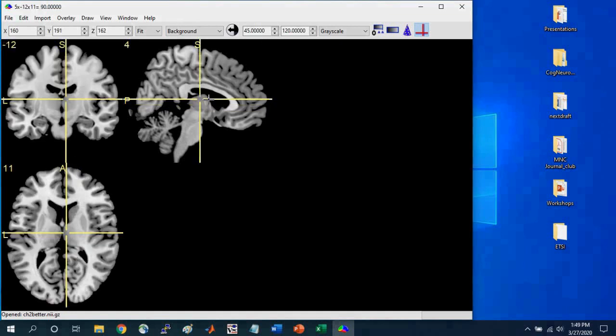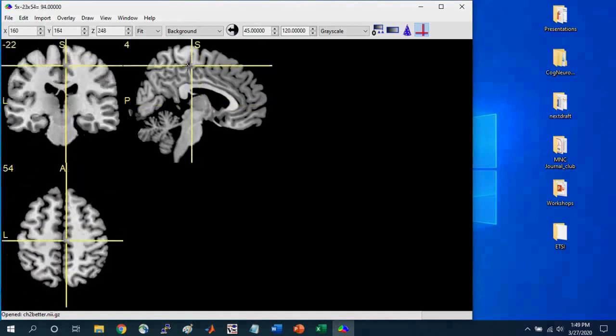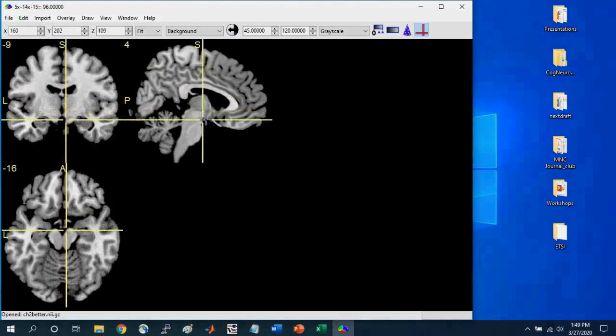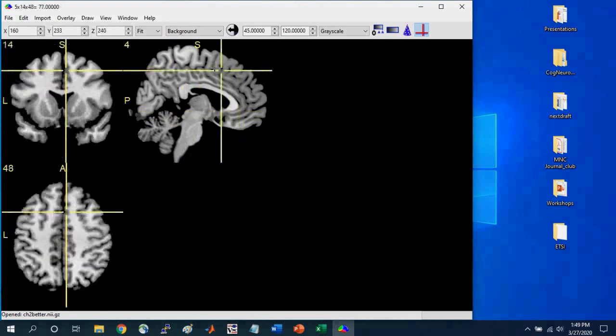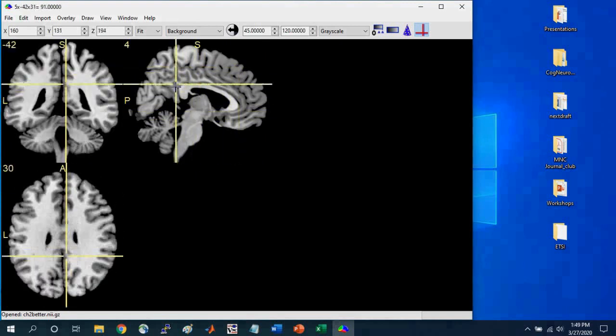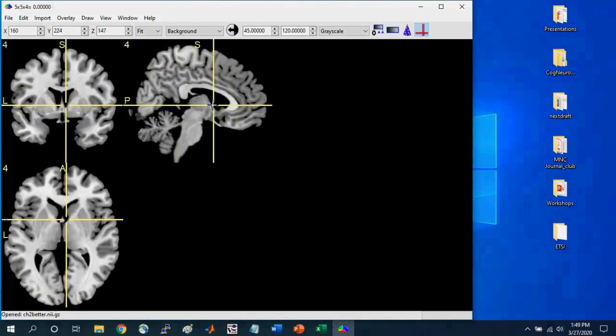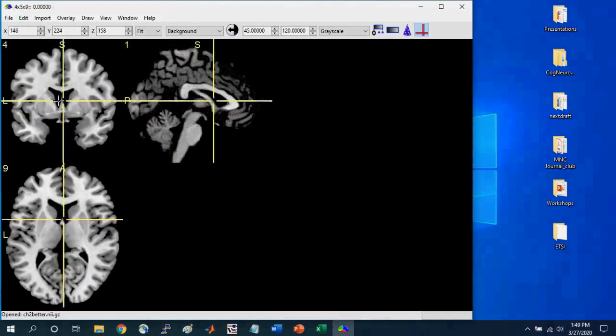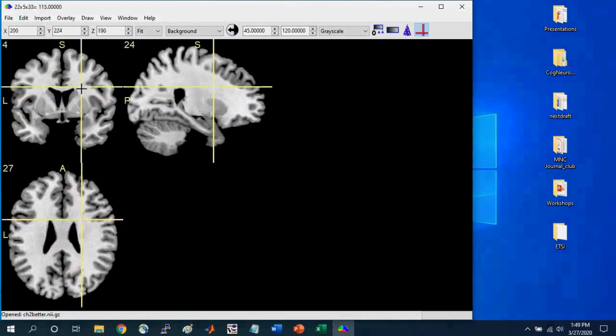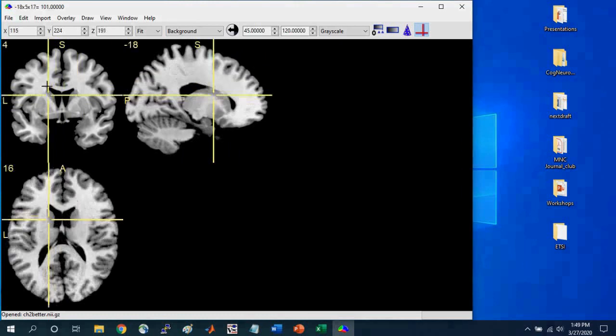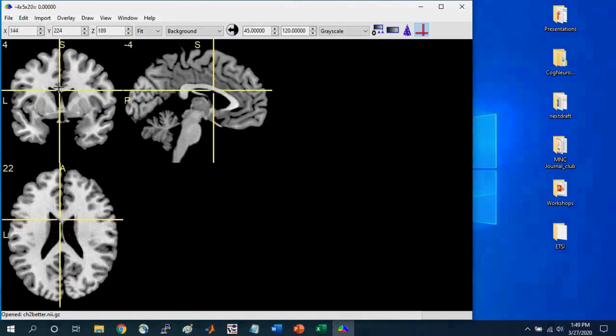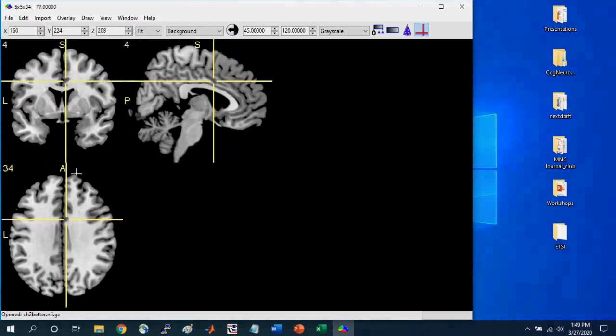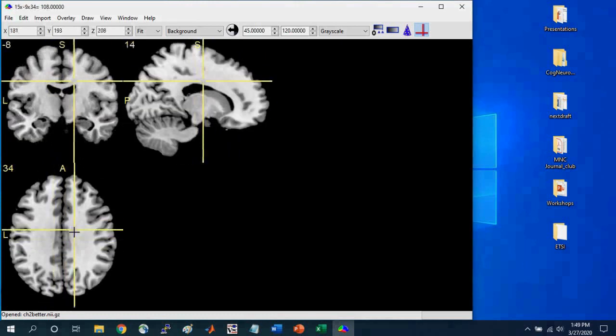And so the orientations of these different slices have names. So this is the sagittal slice that I'm selecting right here, okay? This is the coronal slice that I'm selecting right here. And this is the axial slice that I'm selecting right here.